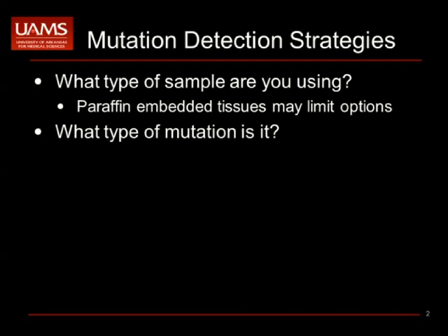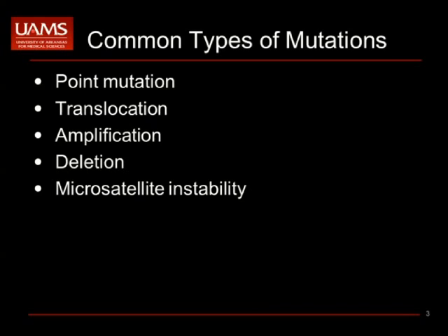You've heard over the course of both days all of us say negative things about paraffin embedded samples. I mean, we all have said it. Now, don't get us wrong. We love our paraffin tissues. I love my tissue. I love my slides. However, they do limit us in certain ways because of those fixation problems that have been talked about over and over again. The second question you need to ask yourself is, what mutation are you detecting?